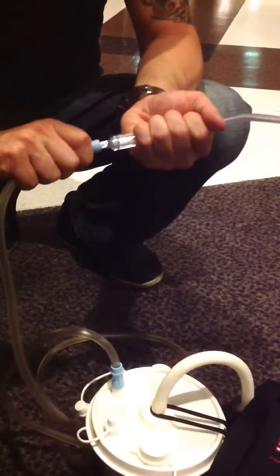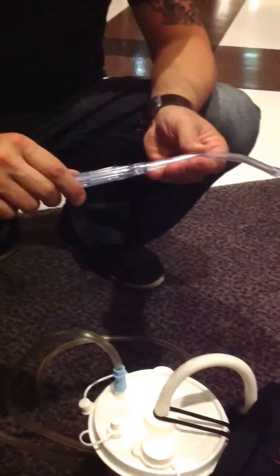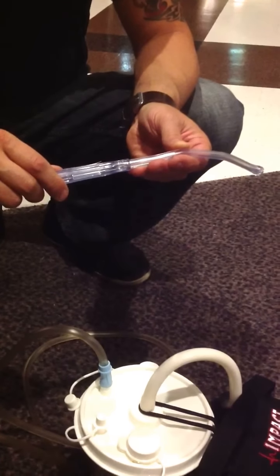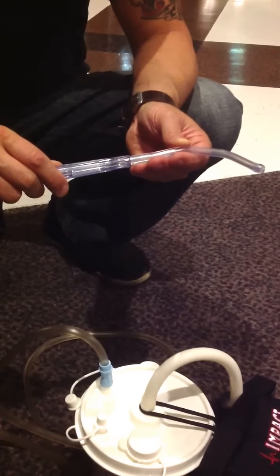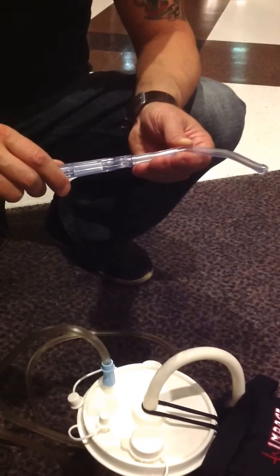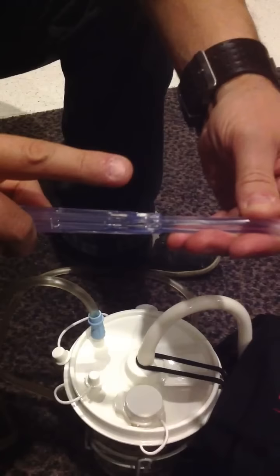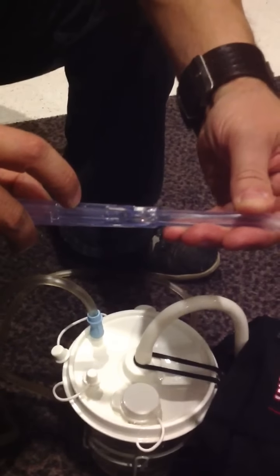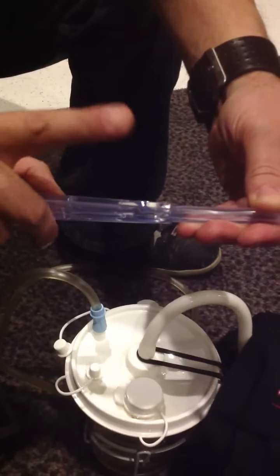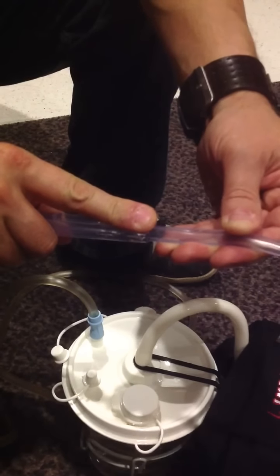So I'm going to go over the techniques used for the actual suctioning process, and then the EMT will demonstrate them. On the rigid tip, you'll see that on the handle there is a small hole. When the machine is normally turned on, there's no actual vacuum at the end of the tip, so it won't actually suction anything out. So the EMT has to cover the hole, which then creates suction at the tip.